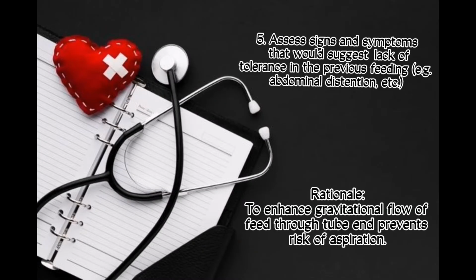The next procedure is to assess signs and symptoms that would suggest lack of tolerance in the previous feeding, for example, abdominal distension, etc. To enhance gravitational flow of feed through tube and prevents risk of aspirations.